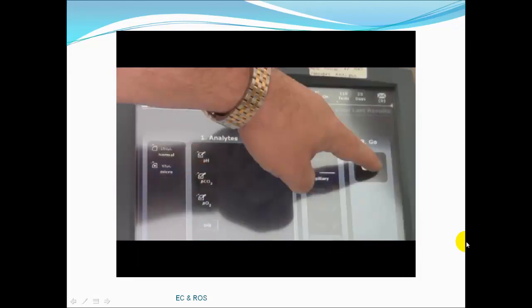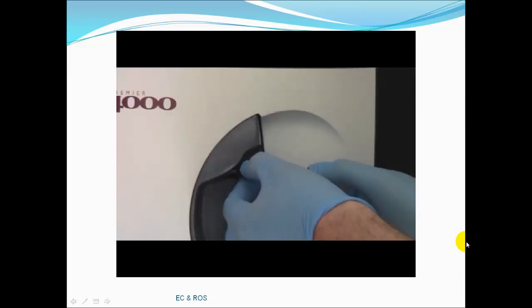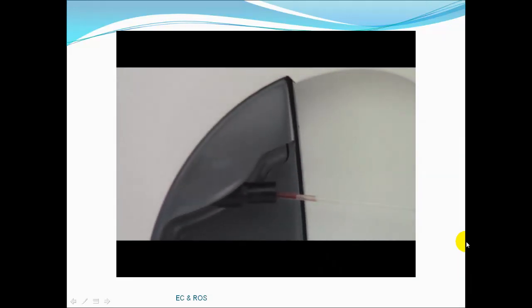Add the sample to the blood gas analyzer, and the midwife, confident in its use, inputs patient details and processes the sample. The results will then be displayed on screen and printed. Document the results on the CTG, in the maternal medical notes and in the baby's chart. Sources of error include the presence of air bubbles, contamination with meconium or amniotic fluid, scalp edema or caput, and a delay in processing of the sample.